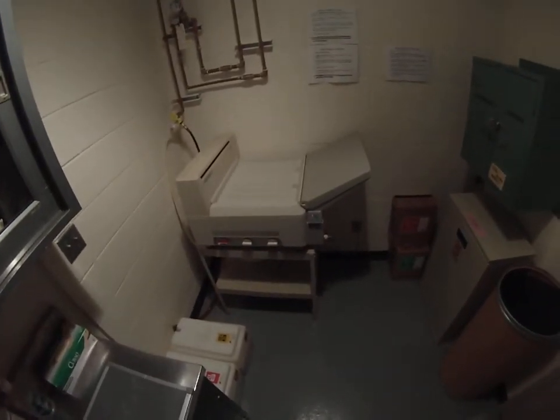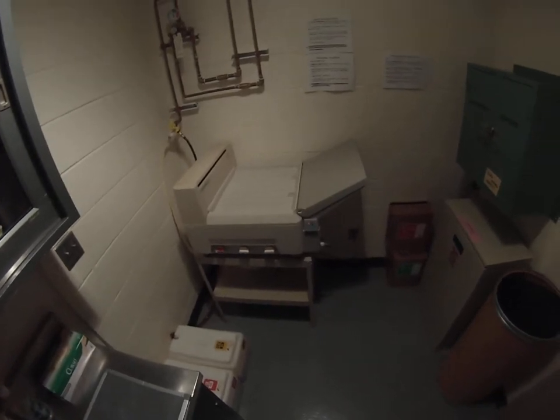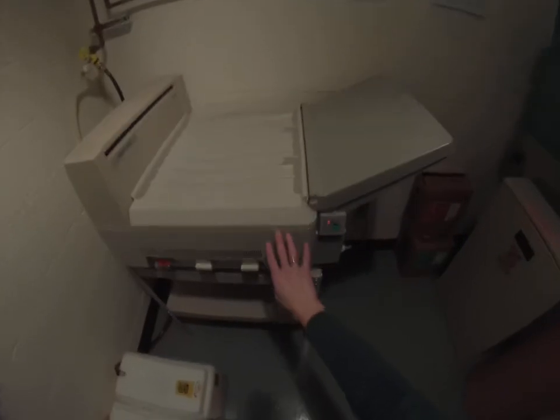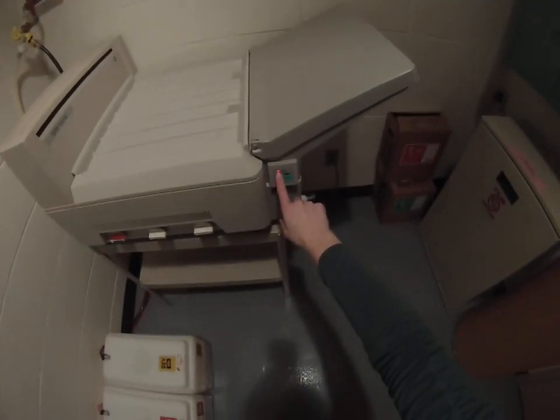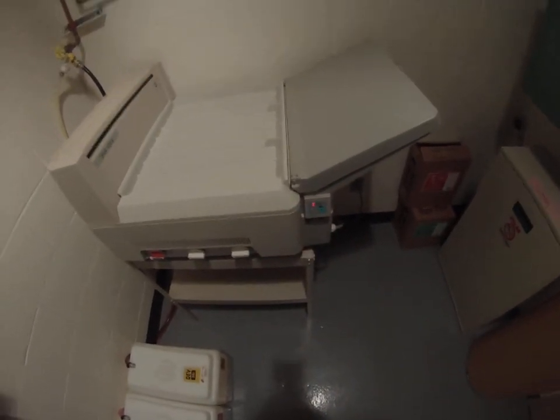Hi, everyone. In this video, we will go through how to process a film in the automatic radiograph processor. Before we consider processing, we need to look at our processor and make sure we see the red light next to the ready button. The processor is now ready to be used.